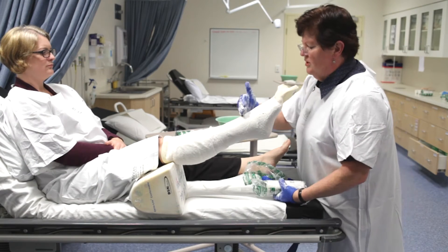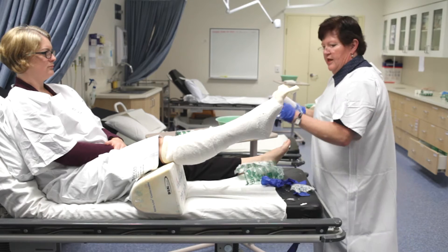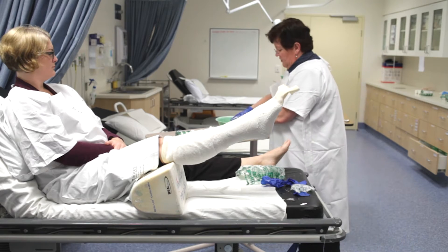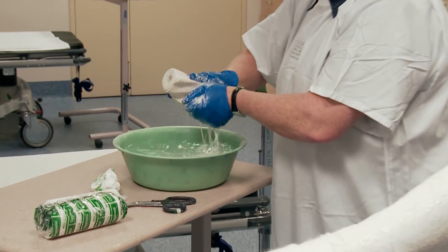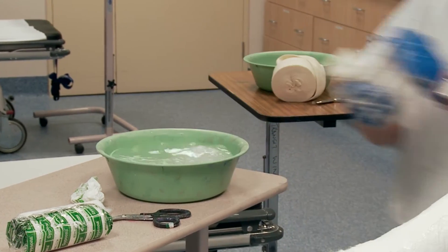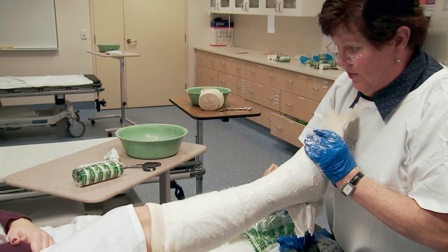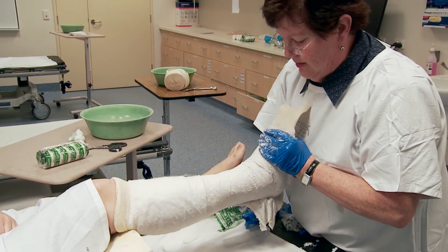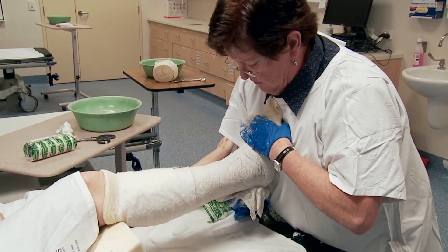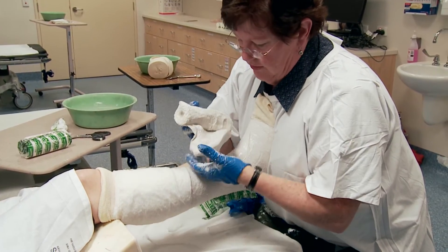The second roll goes from the fracture side to the top. When I start that, I'm going to put your ankle into 90 degrees. The easiest way to do that is to use your shoulder. If you bend your knee, it will automatically go up to 90 degrees. Just relax — bend your knee, relax. Hopefully that's at 90 degrees.